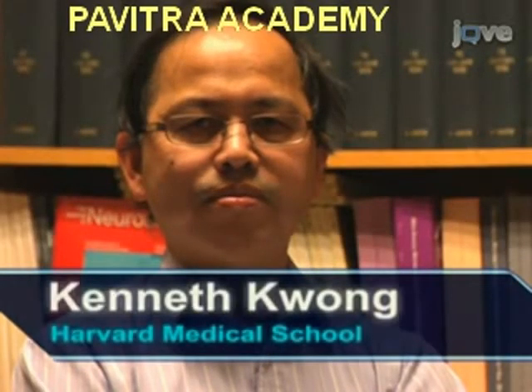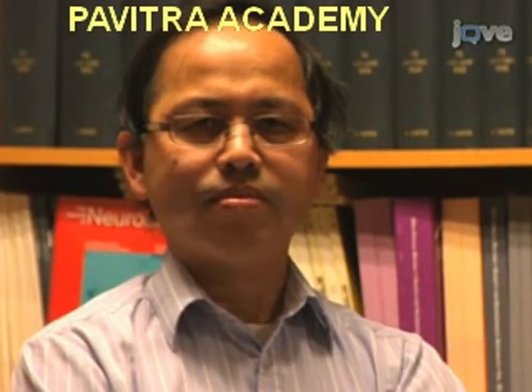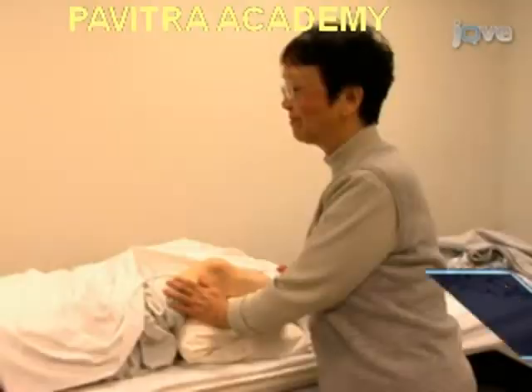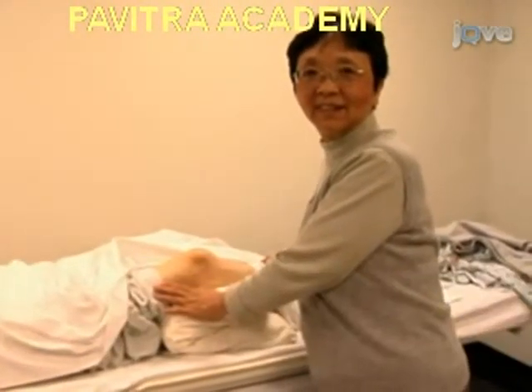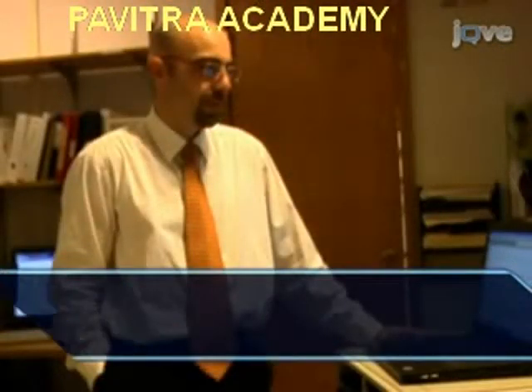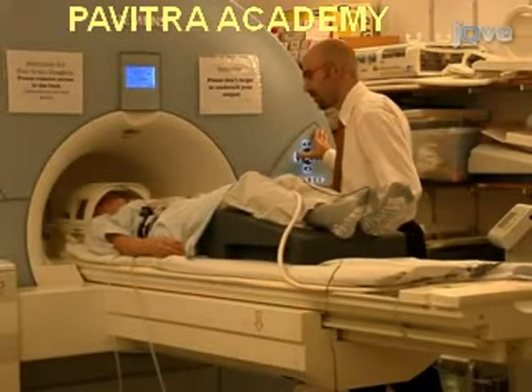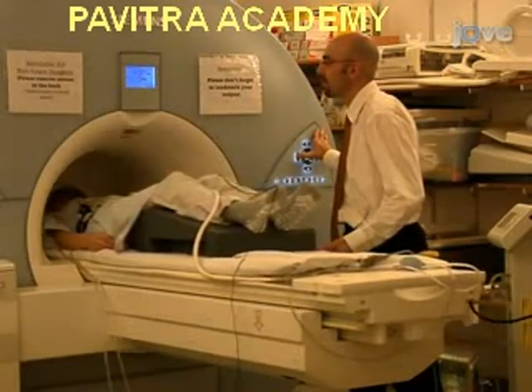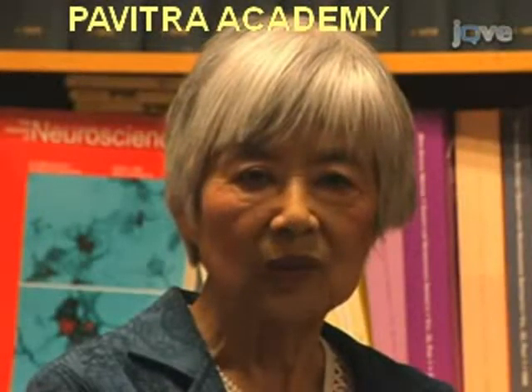Dr. Kenneth Kwong, MRI physicist from the Martino Center, directed the fMRI imaging in these studies. He will be delivering the concluding remarks. Ming Lee, practicing acupuncturist and research acupuncturist at the center, will perform the acupuncture procedures. Dr. Vitaly Nepodol, expert in acupuncture fMRI at the center, will demonstrate the data acquisition process with physiological monitoring. So, let's get started.